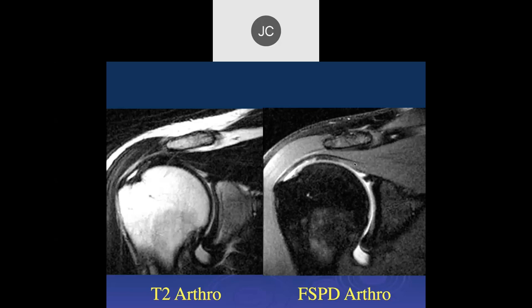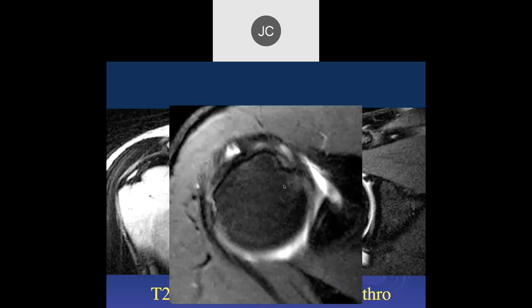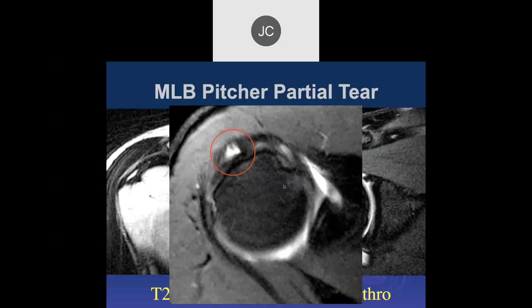Looking at the supraspinatus tendon, there's some undersurface signal. On the fat-sat it looks like at least interstitial tearing, maybe 50%. Here's the axial image — some interstitial signal. This was a high-grade interstitial partial tear in a Major League Baseball pitcher. He went to some physical therapy and then ended up pitching for the rest of the season — and to my knowledge, he never went to surgery.